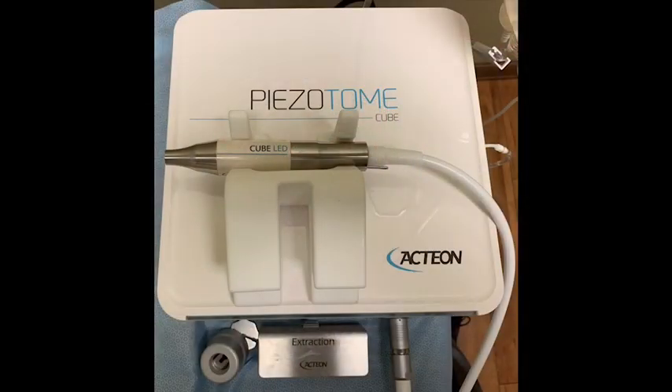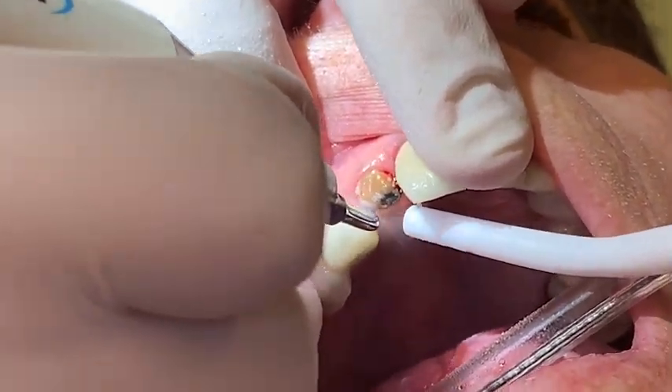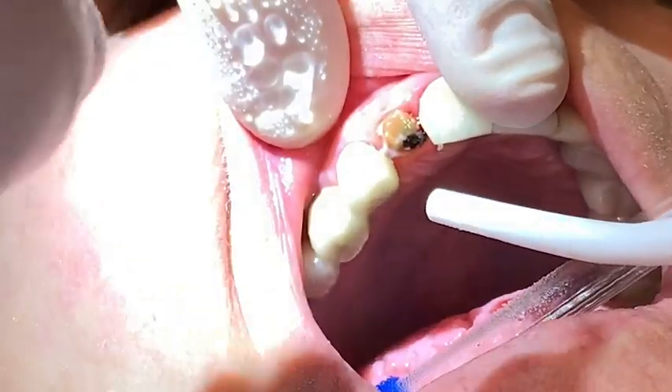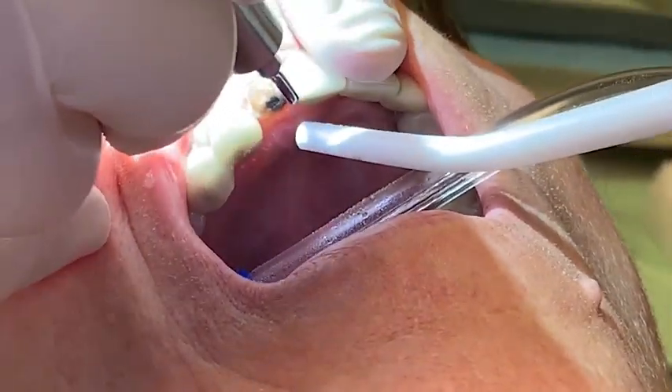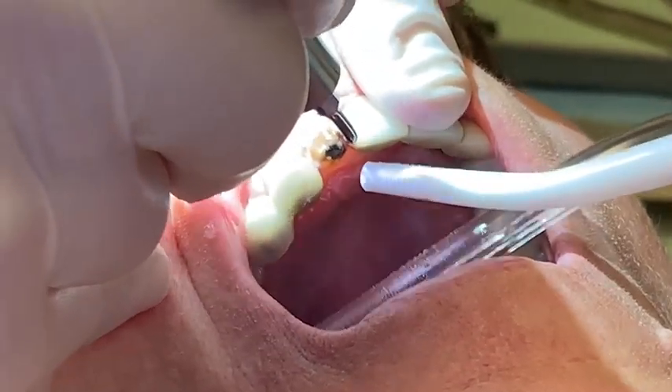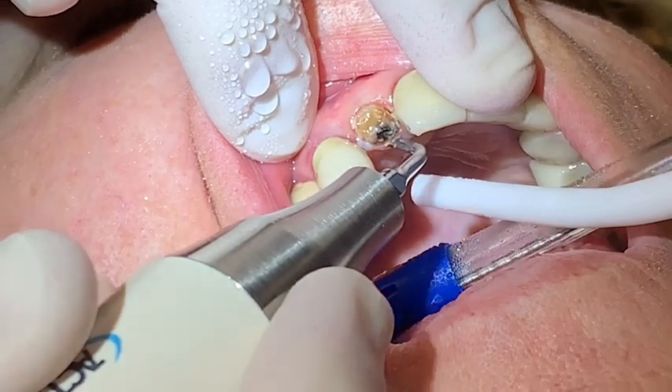The procedure involved using the piezotome cube from Acteon to facilitate the removal of the tooth with minimal damage to the surrounding bone. Maintaining the buccal plate of bone is crucial for the success of an immediate implant placement. The piezotome is activated before it is placed in the mouth and then inserted into the socket using a constant up and down motion.